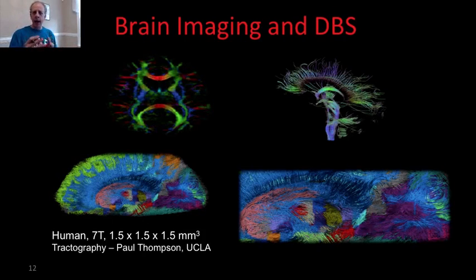What do I mean by that? You basically register them, you align them. We talked about registration when we were talking about HIV and image processing for viruses. So you put all of them in the same coordinate system. You might be able to bring the atlas in as well if you wish to do so.